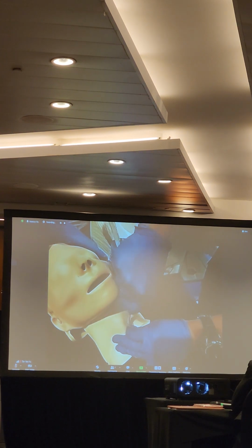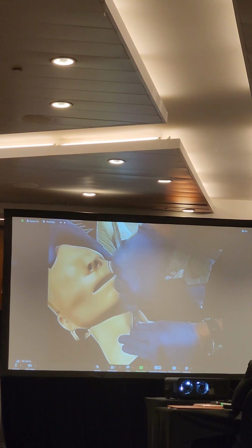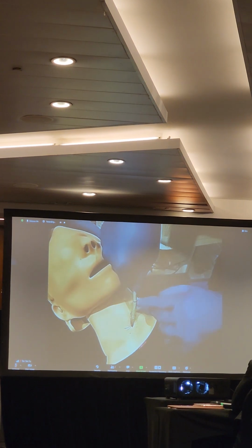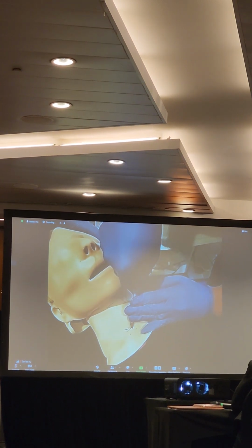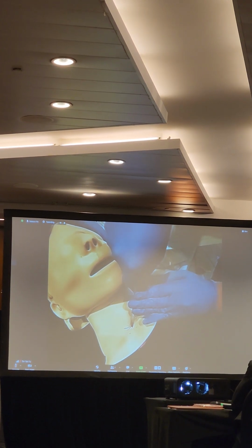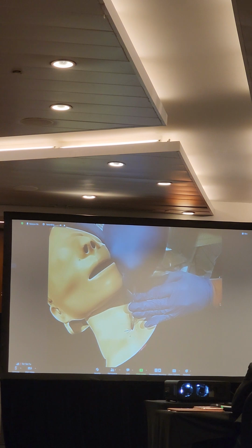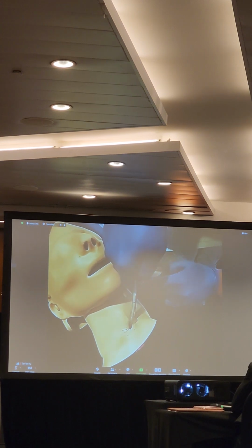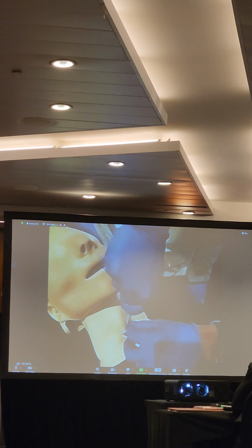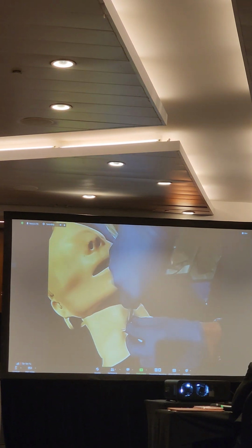You have to be very careful because if you notice over here, this is the upper cuff. There's a black line over here. Usually we try to put it about 3 to 4 centimeters deep at least above the upper cuff. And I made a mental note before that this will be roughly around here. So if I go in, it takes a bit of strength. And this is why you need the dominant hand.